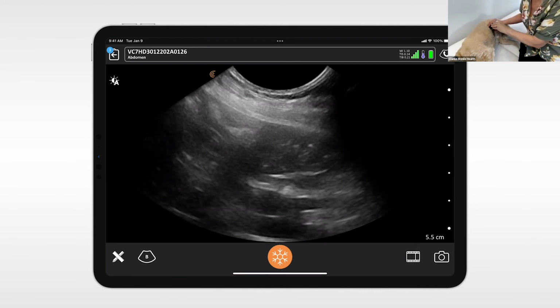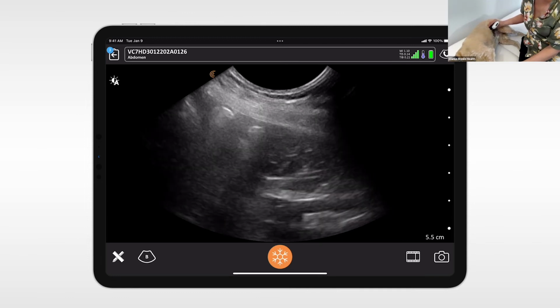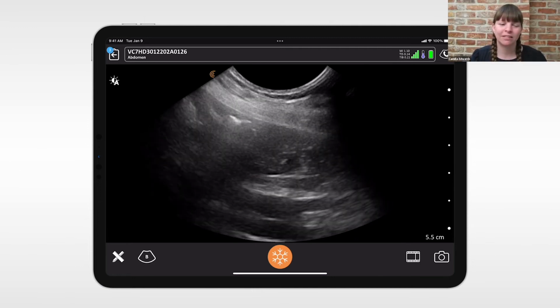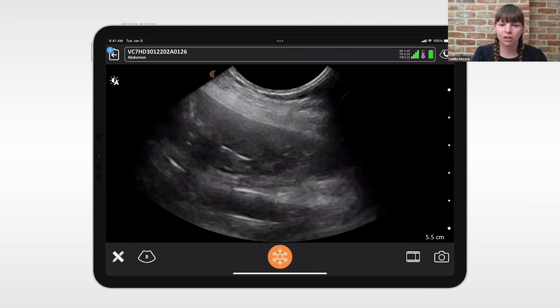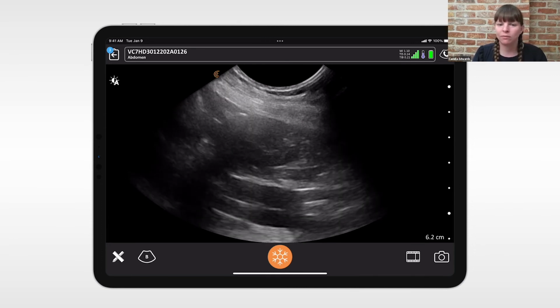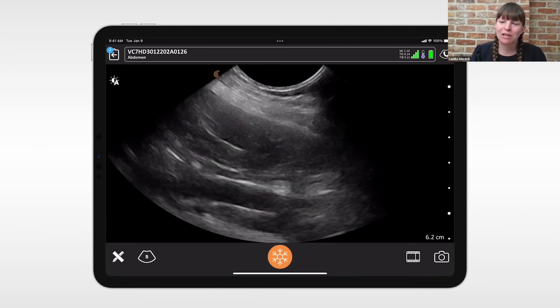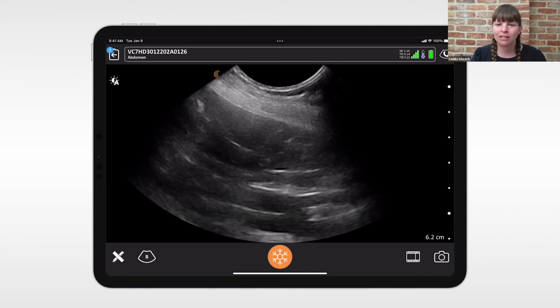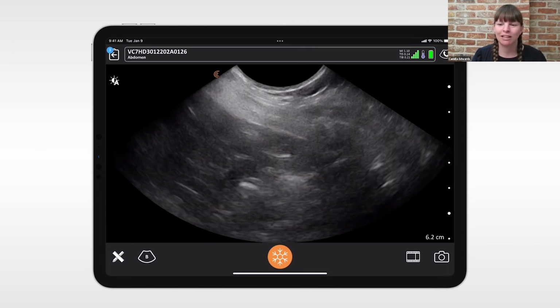It's funny, as a sonographer, your habit is, if you can't see something, you just press harder. It doesn't always work. No, pressure is one of those things that often people aren't aware of how much pressure they're applying. I see that a lot when I'm teaching: people know when they're sliding or fanning or rotating, but they're not as aware of when they're adding too much pressure or even not adding enough pressure. I think people fall into two camps. You either apply too much pressure or not enough pressure. But it's a skill. For some things you need to release the pressure, and for some things you need to add pressure. And this is definitely one where you need to release the pressure.